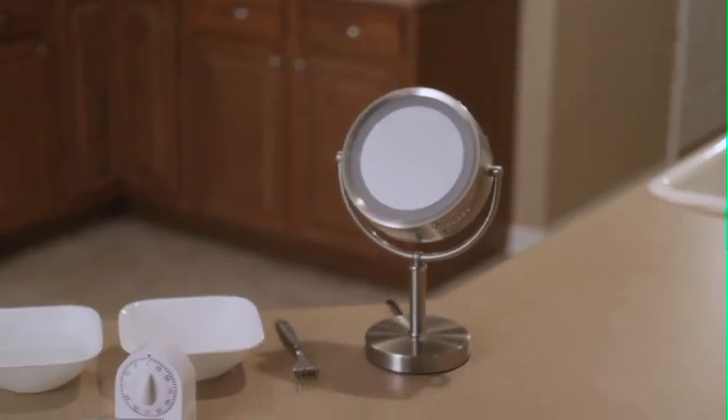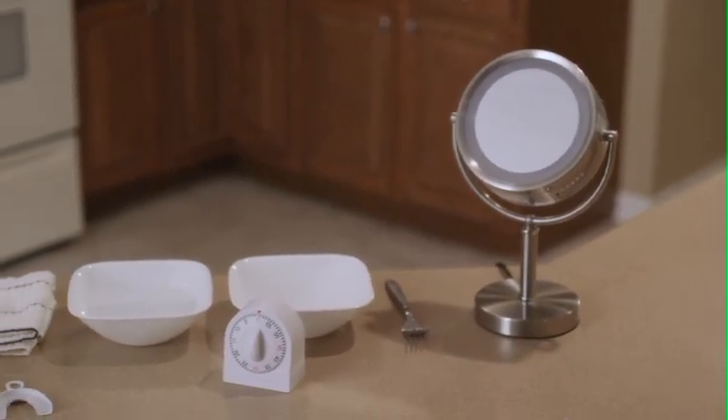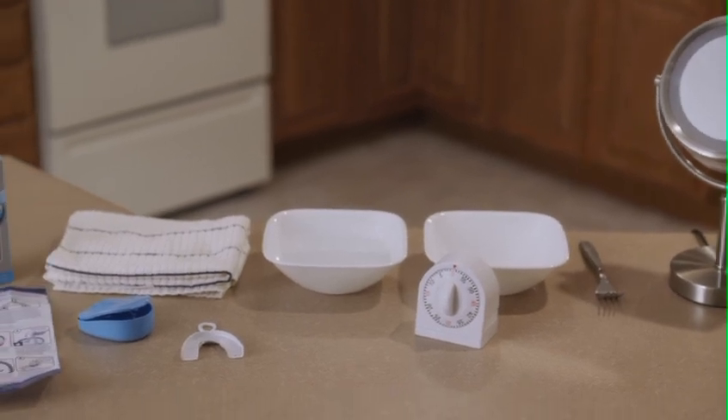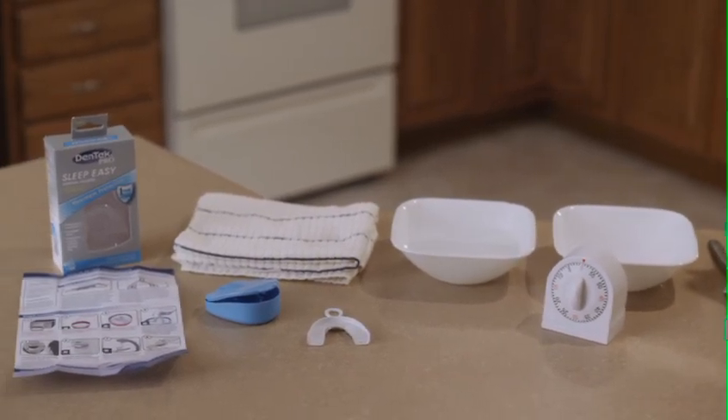To fit your SleepEasy Dental Guard, you will need a microwavable bowl or stove pot, a bowl of room temperature water, a mirror, a metal fork, a timer, and a microwave.